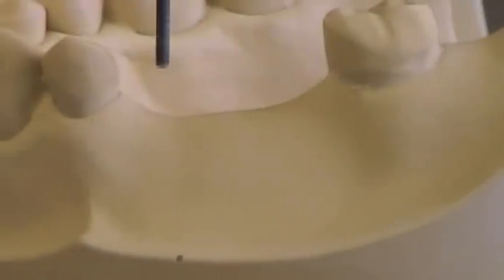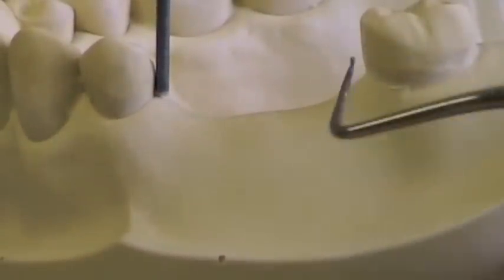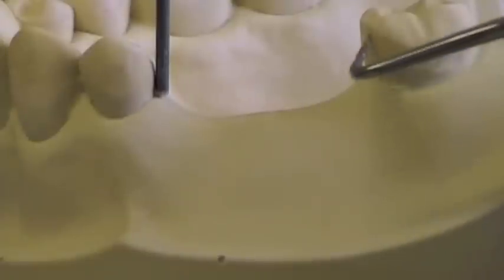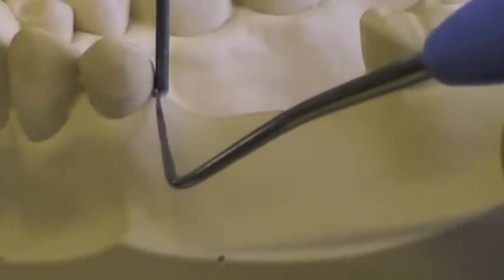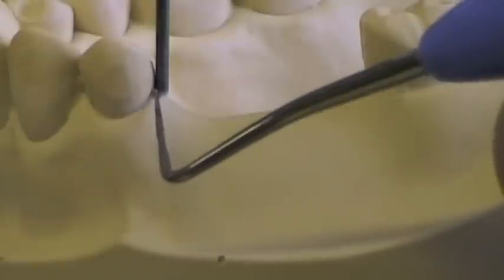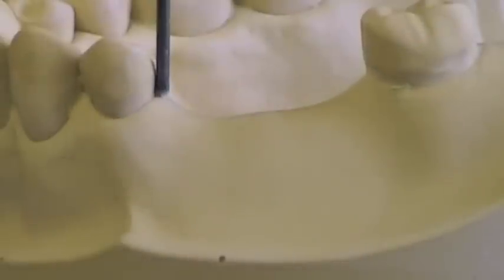Line that up as best as you can, then move over to one of the other teeth and make sure things are fairly parallel. You can see here, when we've lined up our molar so that it's perfectly parallel, this premolar looks pretty good. The height of contour is down low, we've got a fairly wide guide plane. You can see there's a little bit of space between the analyzing rod and the tooth at the occlusal surface — that means this guiding plane is slightly divergent, but we don't have an undercut.